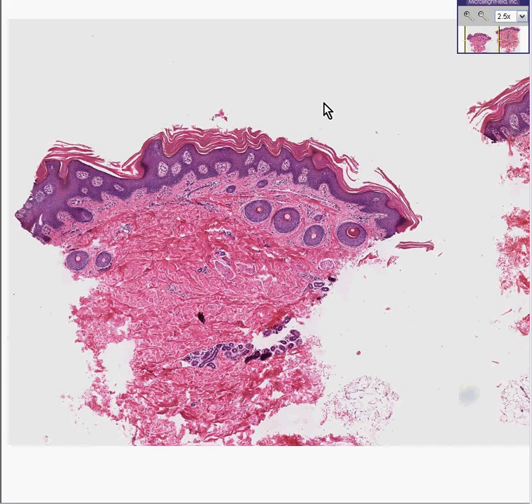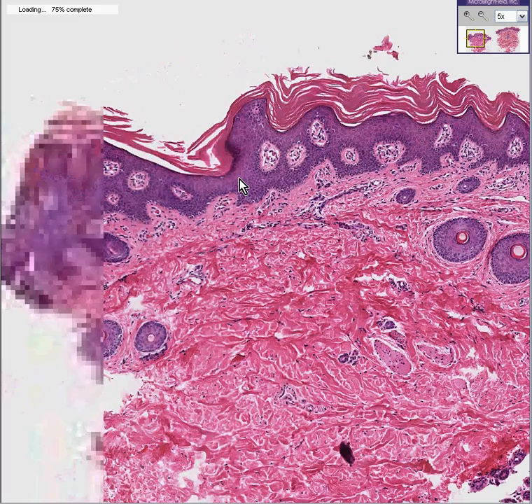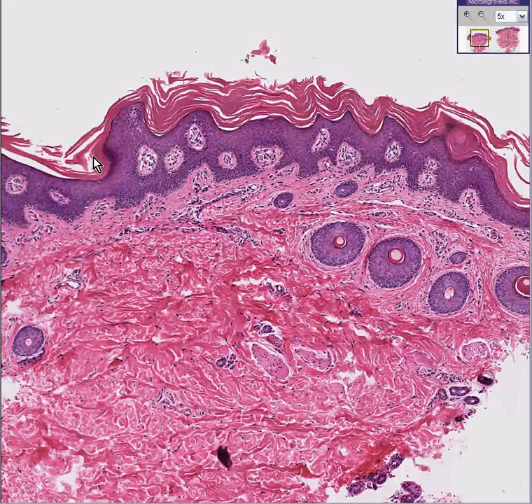This is another classical example of a skin disease in which the histopathology does no justice whatsoever to the skin disease. In fact, it almost misleads you. Well, let's describe the skin. We could see hair follicles, deep dermis, papillary dermis, and epidermis. And really, in all honesty, the most prominent thing you would notice abnormal about this is that there is a hyperkeratosis.